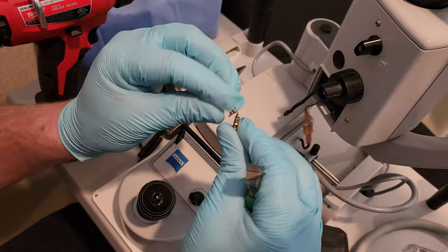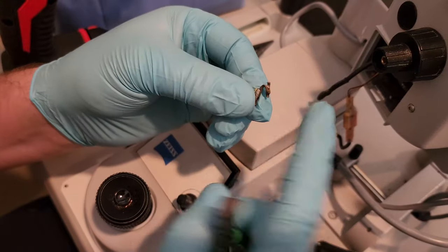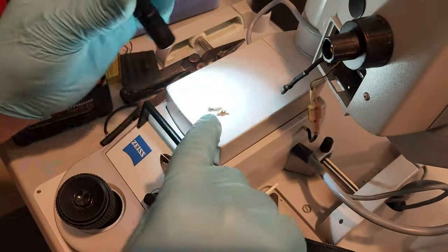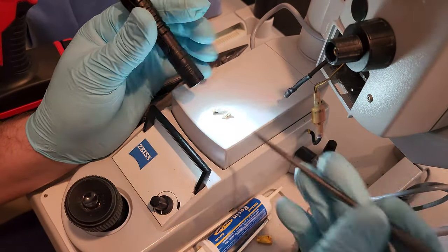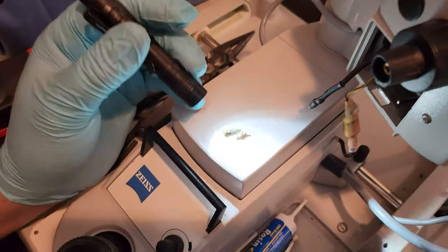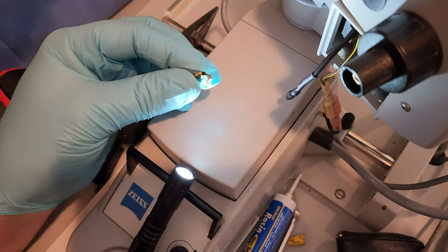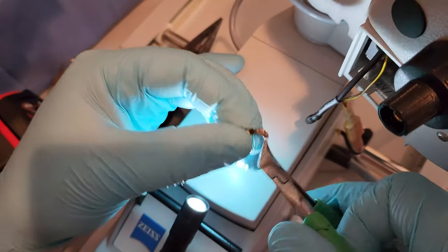Okay, and you can see what they did is they bent over the push-on connector and then they soldered the wire to it on the back, but it created this really rough edge, and this really rough edge right here is what stuck through the shrink tube, and now you just lost any insulation that you thought because you left it like this. So what we do is we clean out the inside of the connector. I'm going to clip it. There we go. So I'm gonna straighten this guy out just a little bit, just like that, and clip it.